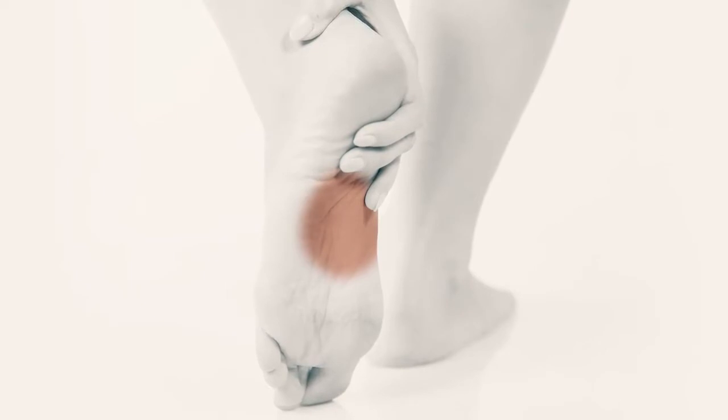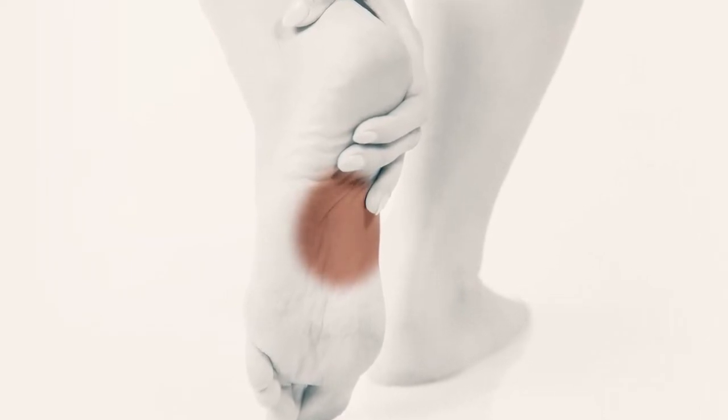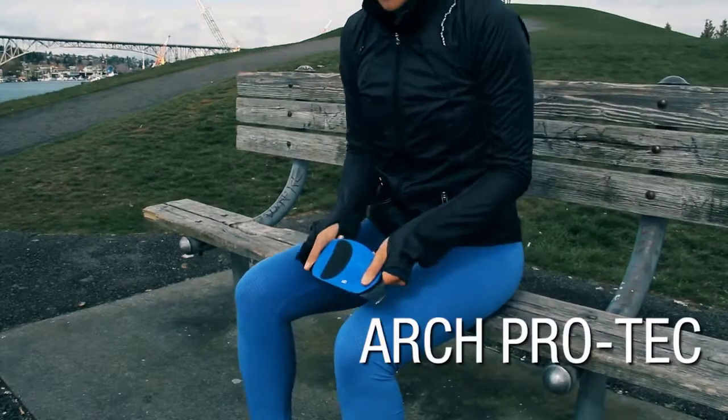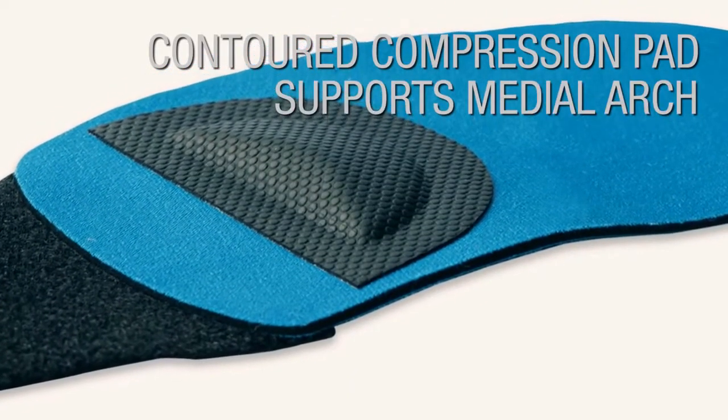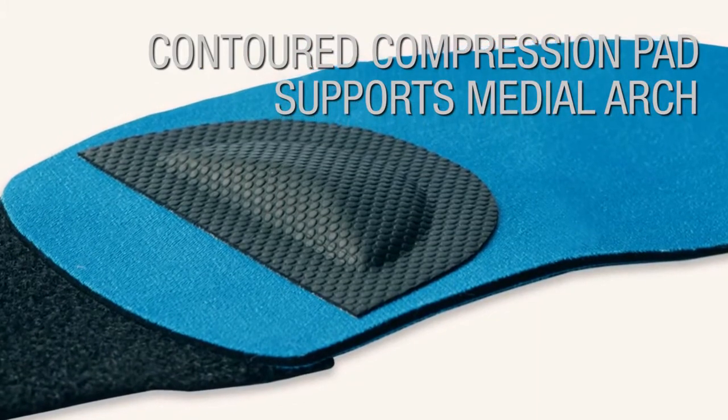If you suffer from plantar fasciitis, one of the most common causes of arch and heel pain, then the Arch Pro-Tech is for you. Our contoured compression pad provides comfortable support to your medial arch, reducing excessive pronation.